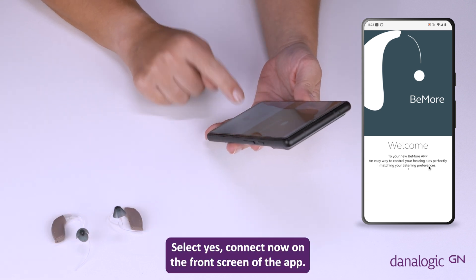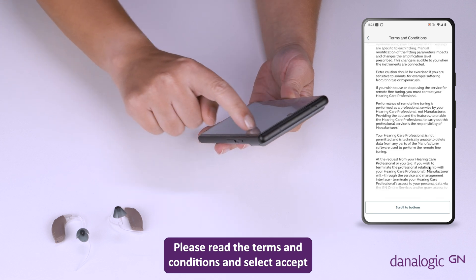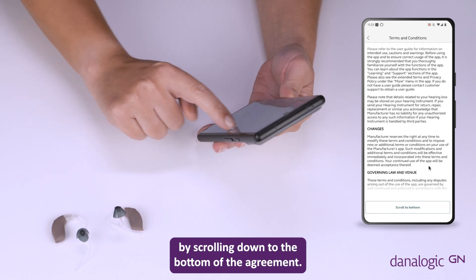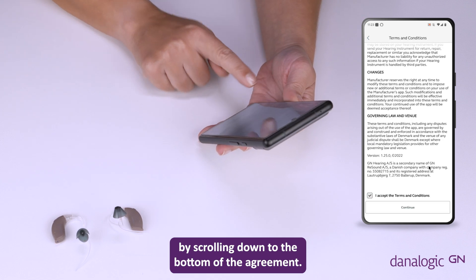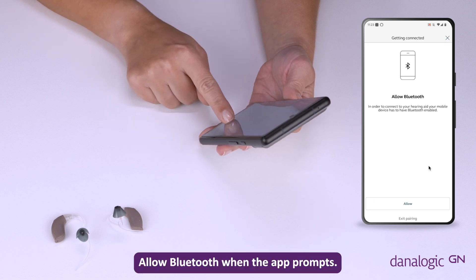Select 'Yes, connect now' on the front screen of the app. Please read the terms and conditions and select accept by scrolling down to the bottom of the agreement. Allow Bluetooth when the app prompts.